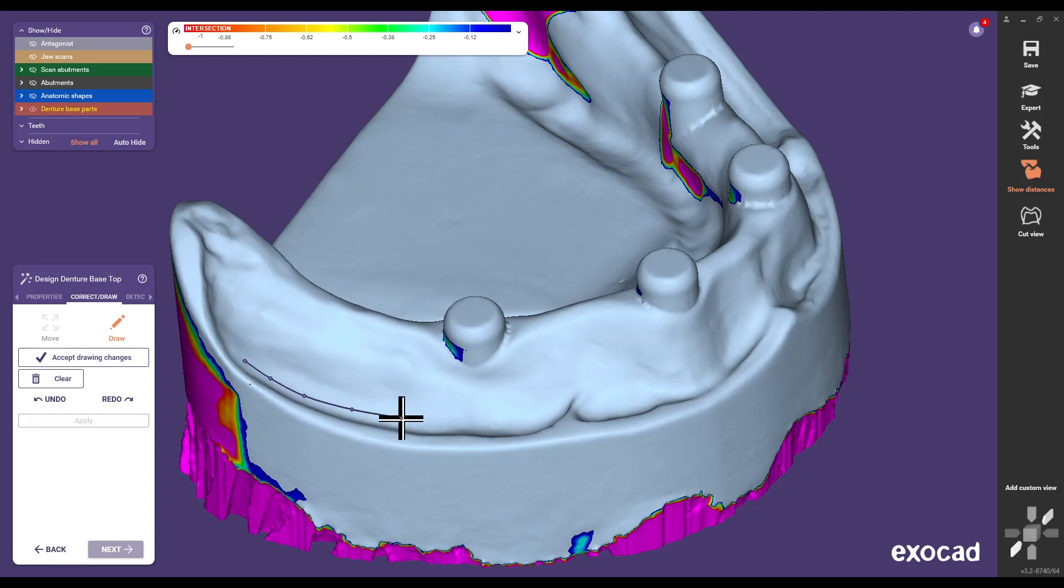Draw the borderline of the Gingiva base of the prosthesis according to dental requirements.